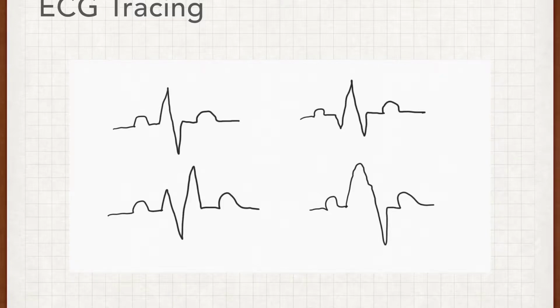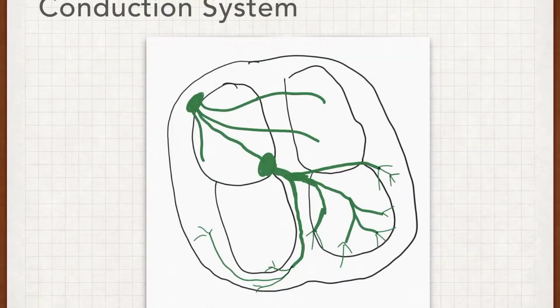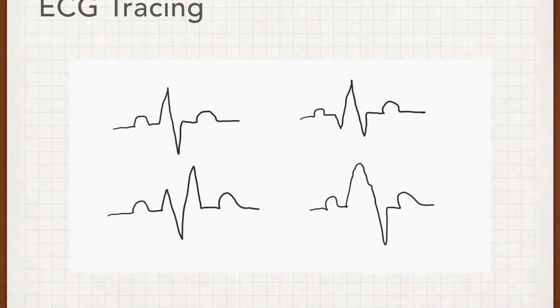Want you to remember QRS complexes, what everything is called.